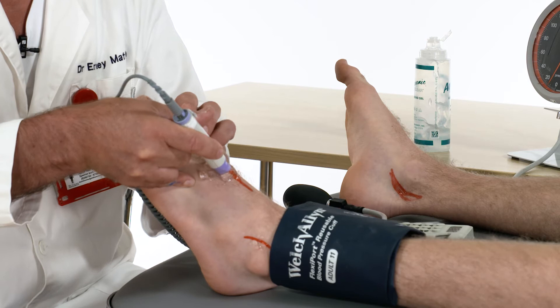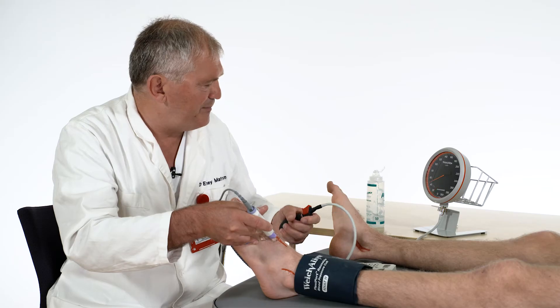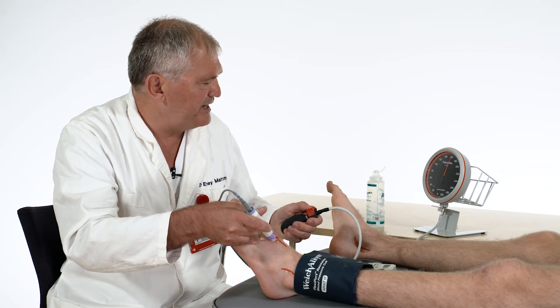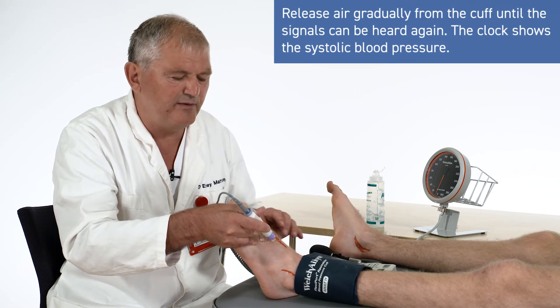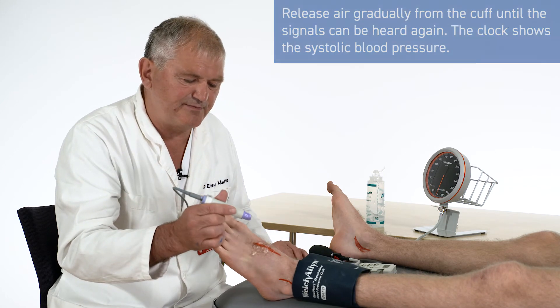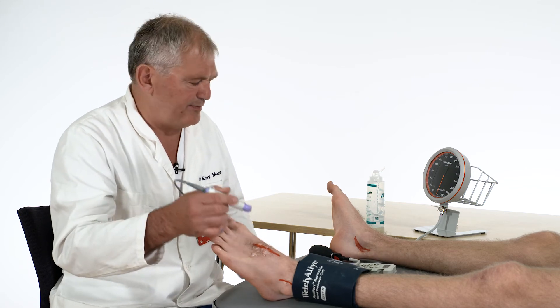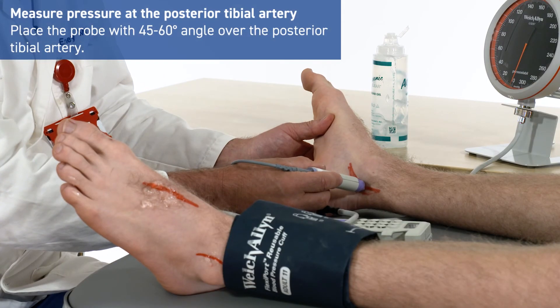Put the probe in place, and now if the patient moves his foot you will not lose your position. Then pump up to above systolic pressure and release the pressure rather quickly — the reason being that thereby you reduce the time and the risk of losing position for the probe.